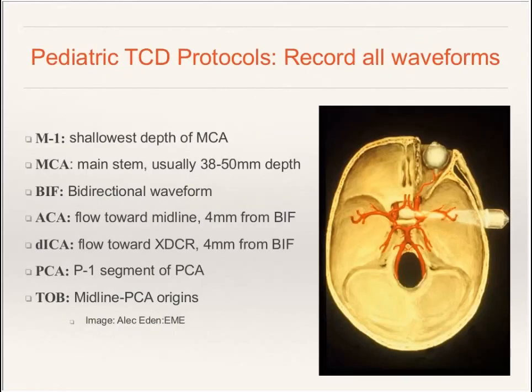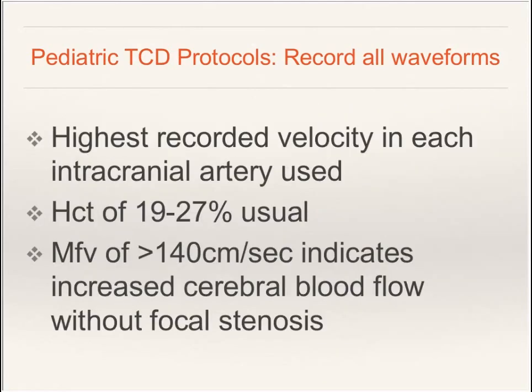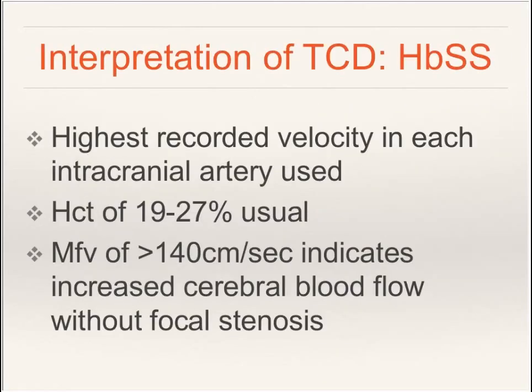So the pediatric TCD protocols, we look at the M1, the MCA, the bifurcation, the ACA, the distal internal carotid, the posterior cerebral artery, and the top of the basilar showing the midline. All of these can be insonated from the temporal approach.